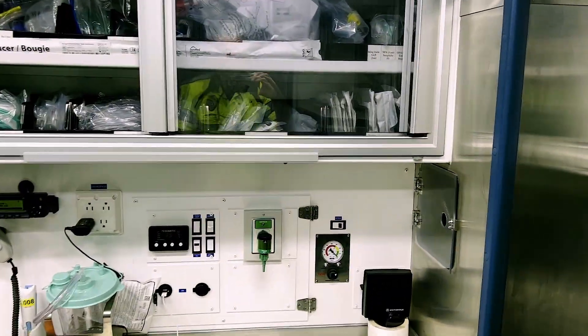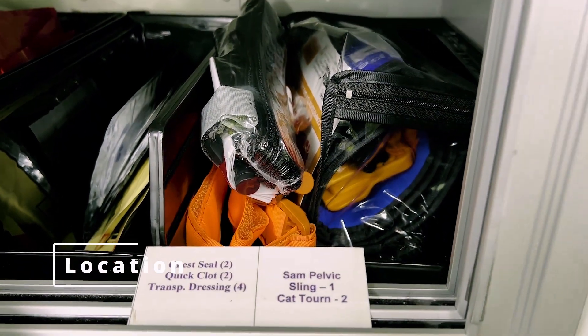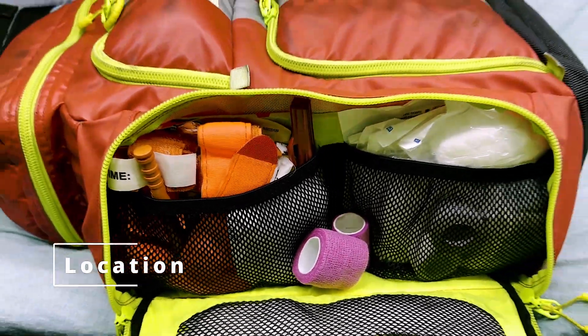We keep at least two combat tourniquets on every ambulance at HCEC. One can be found in the cabinet behind the captain's chair, and the other is in the side pocket of the jump bag.